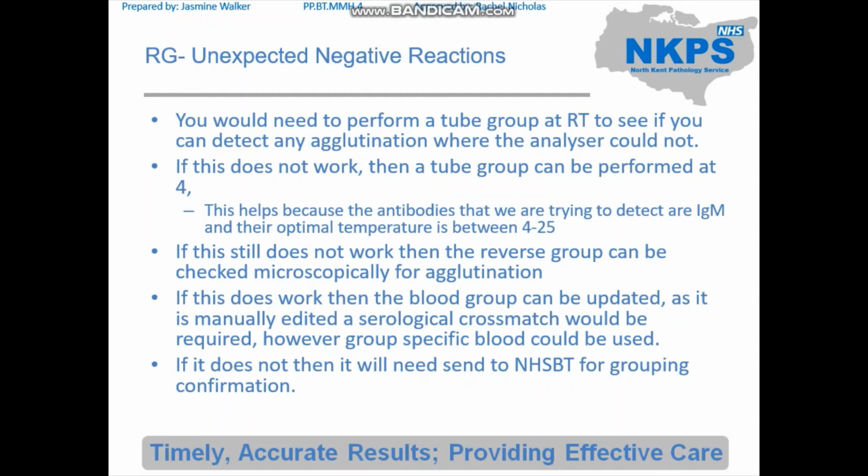If this does work, then the blood group can be updated, and as it's manually edited, a serological cross-match would be required. However, group-specific blood could be issued. If it does not work and you still can't obtain the correct reverse group, then you'd have to send it to the NHSBT for confirmation.